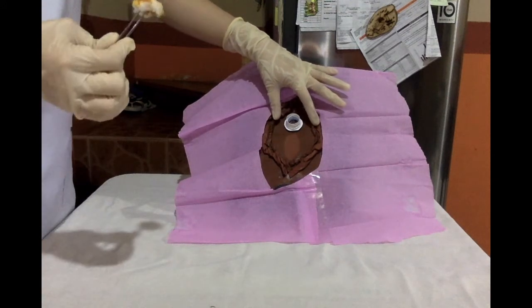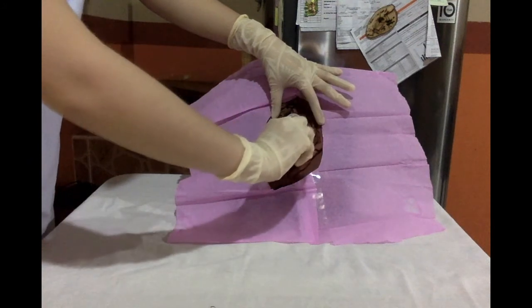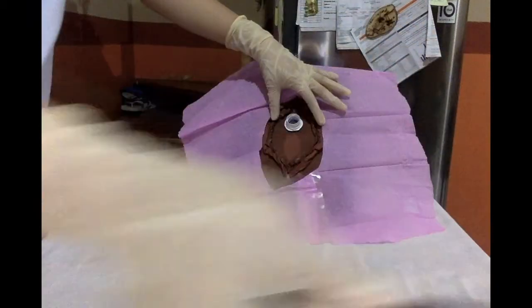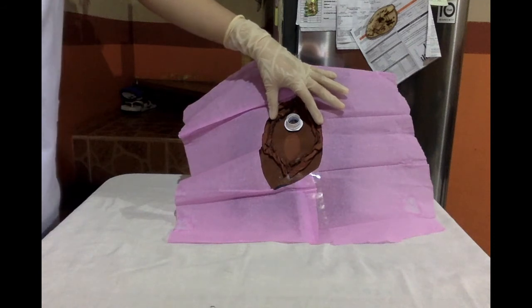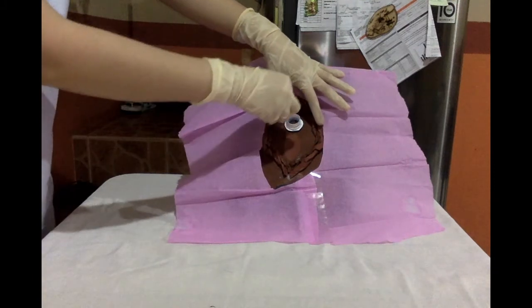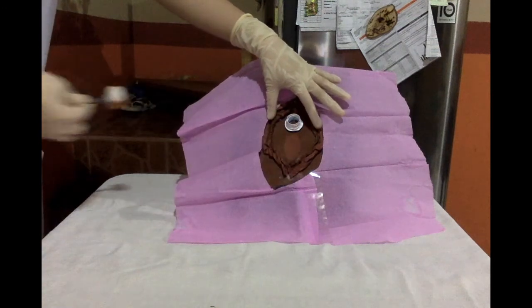Remember, front to back. And then, do not cross the sterile field with the contaminated cotton ball. Discard. Avoid also going back and forth to avoid cross-contamination. The next. Again.